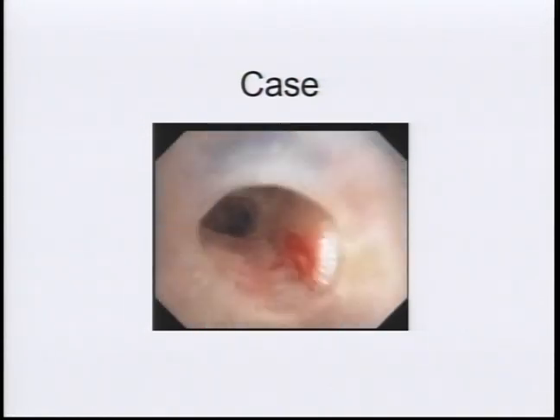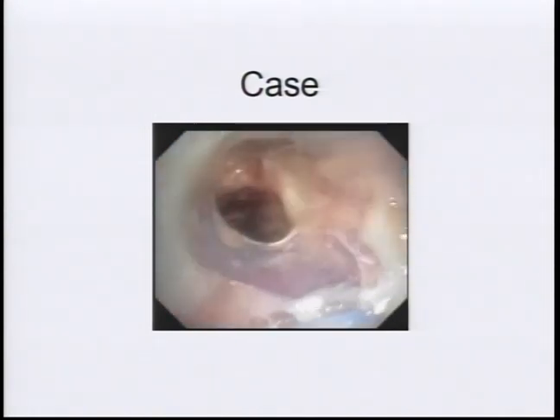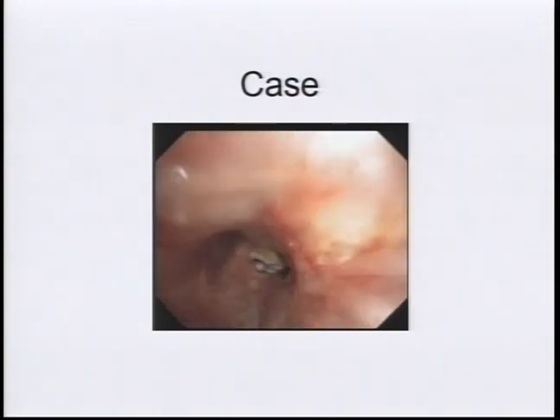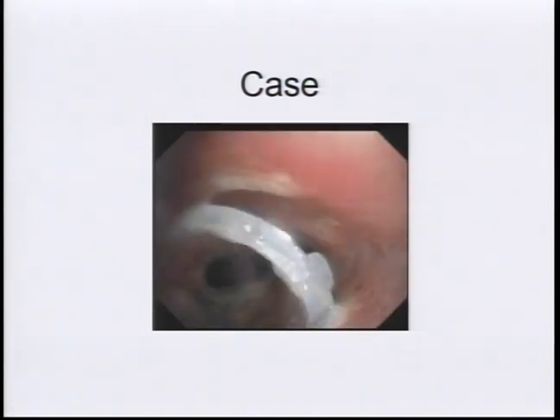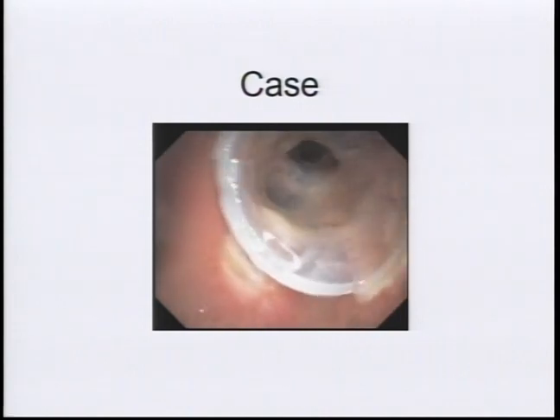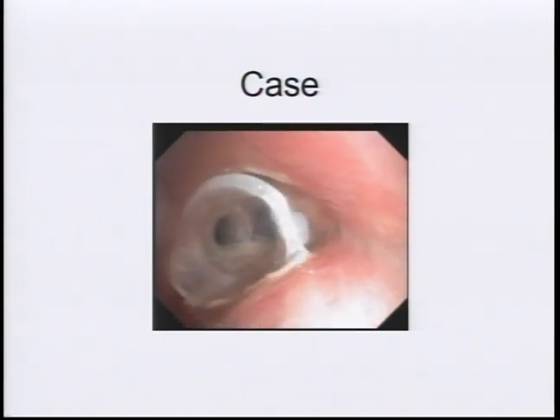See how the left side is pretty open. There's a little scar where the tumor was. And on the right side, she still has some residual disease that we knew was there, and was not really taken out. But she had symptomatic relief from this. And again, this is a palliative intervention. So the goal is to buy some time, maybe buy time until they can get additional therapies if they're candidates for that. These stents are removable.